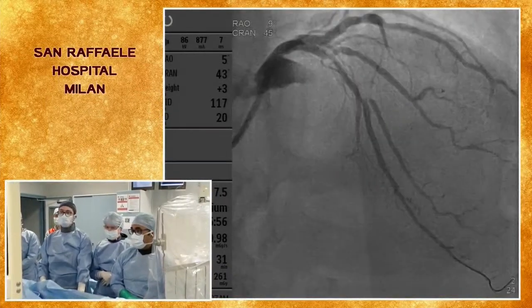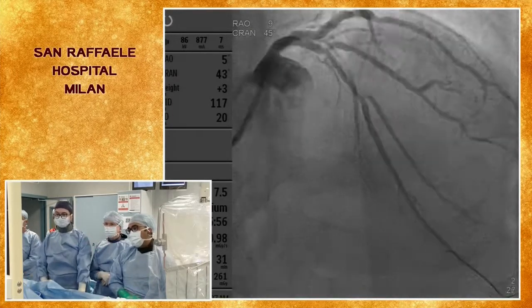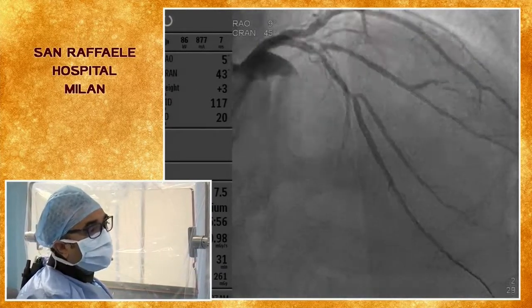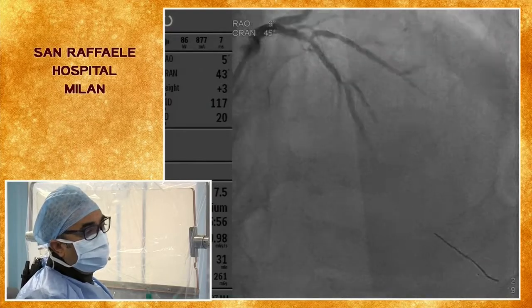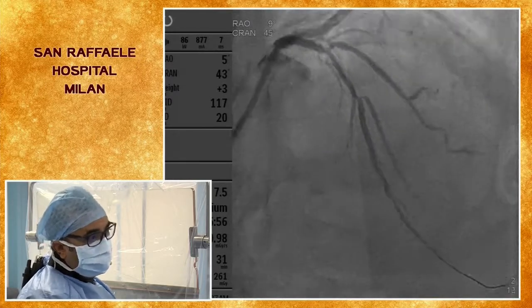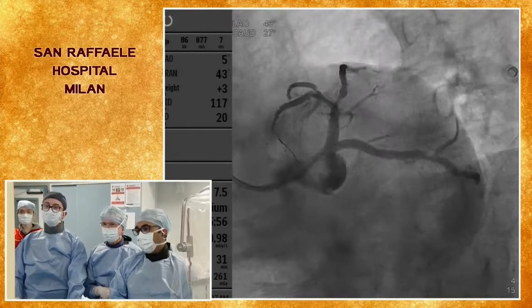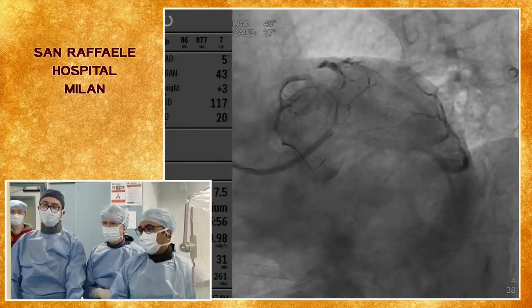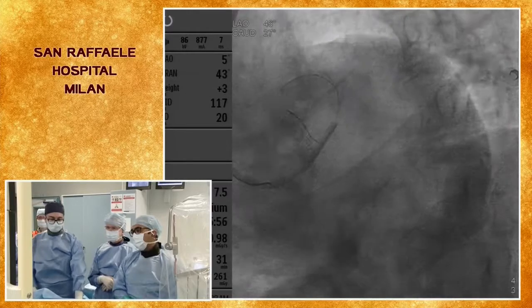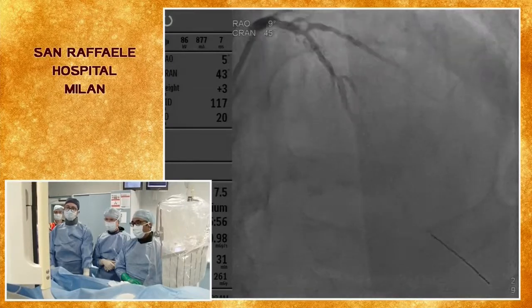We'd love to hear what you think about this lesion. As you can see, there's a stent in the LAD. There's long disease in the LAD involving two important diagonal branches, at least 2.5 millimeters, the first even larger. If you show the spider, you see more clearly the stenosis on the first diagonal. The first diagonal has a critical stenosis, the second diagonal has a critical stenosis, with intermediate disease in the LAD.